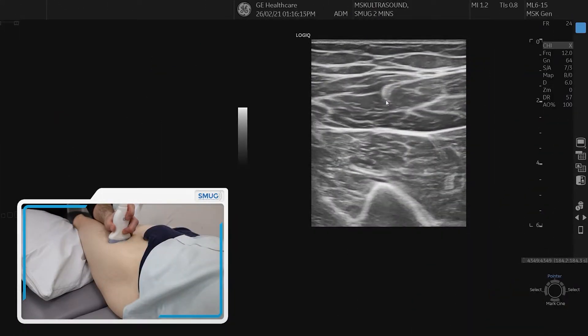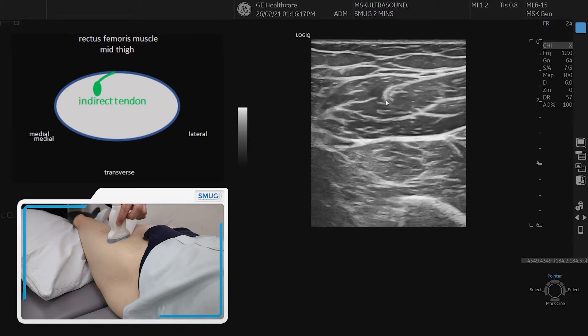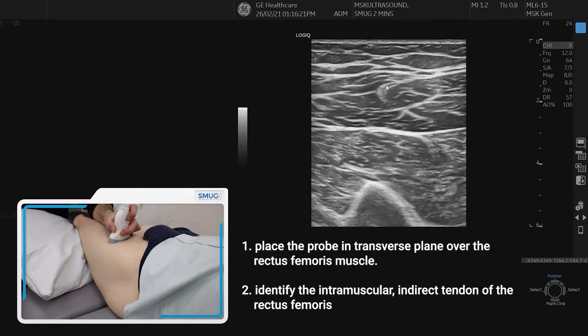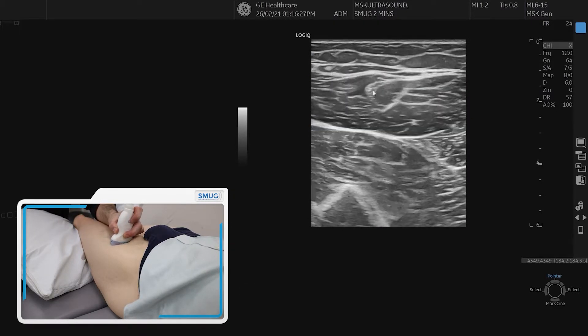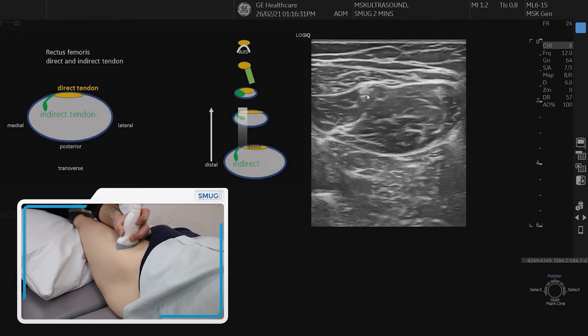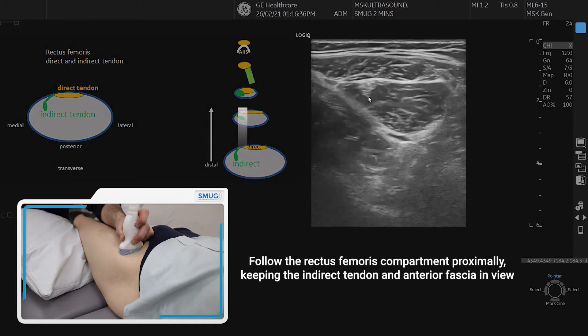Let's show you how you assess the proximal rectus femoris muscle tendon. We start in the middle of the thigh and identify in cross-section the indirect tendon, which is shown here in the image. We keep it in the middle of our screen and keep our eye on it as we go proximally. The tendon slowly goes to the medial corner of this compartment and the muscle gets smaller and smaller as we go.